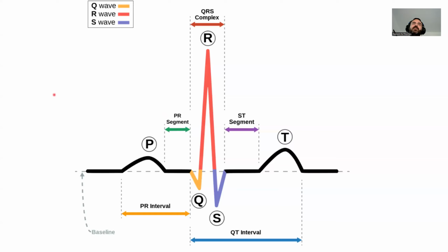Something to remember is that what you're looking at when you see this printed out on your tally paper is monitoring the electricity being conducted through the heart, right? So you see a P wave, and you see a QRS, and you see a T wave. There are some rhythms that can develop, and this ties into why I mentioned that sometimes it can be hard to differentiate between a T wave and a P wave. There are rhythms where you have a lot of electrical activity happening all the time in the heart, right? So I mentioned atrial fibrillation.